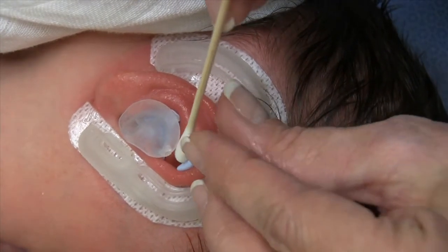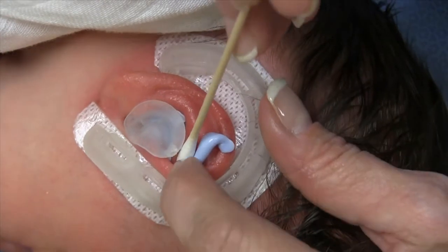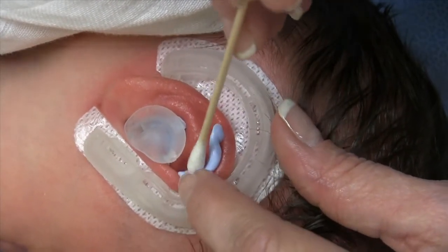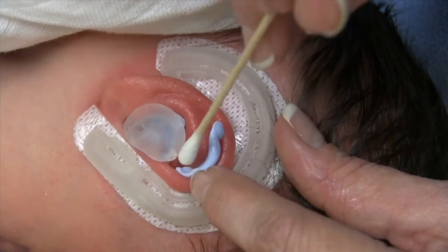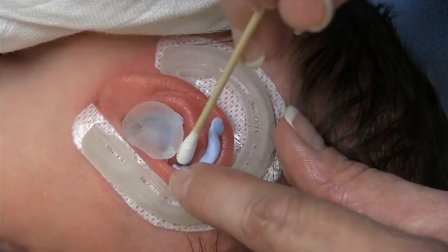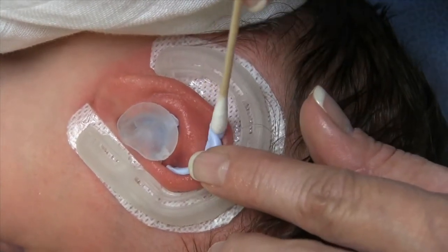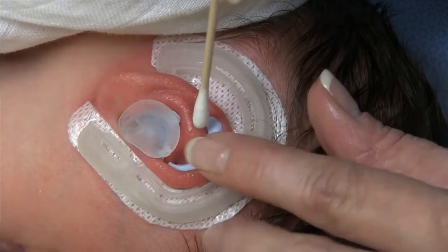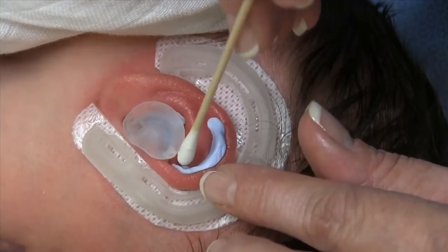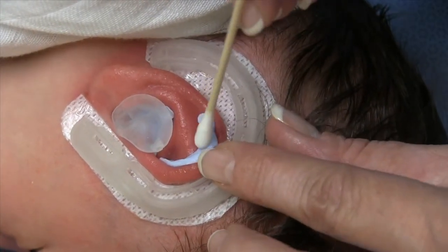I'm just going to lightly lift that from underneath. It's very difficult to treat this area without causing undue pressure, so by putting the prosthesis in here we can supplement the retractors with the ear well. You've got that lift underneath, and you're not causing any undue pressure because we've got the posterior former underneath.